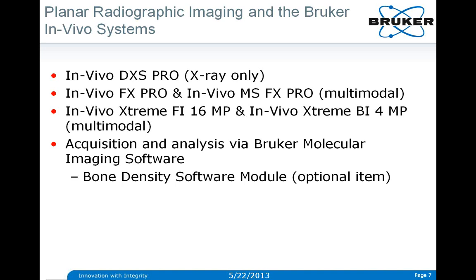And then when the bone density software module, which is an optional item, is installed, it operates essentially as a plug-in within the Bruker molecular imaging software.